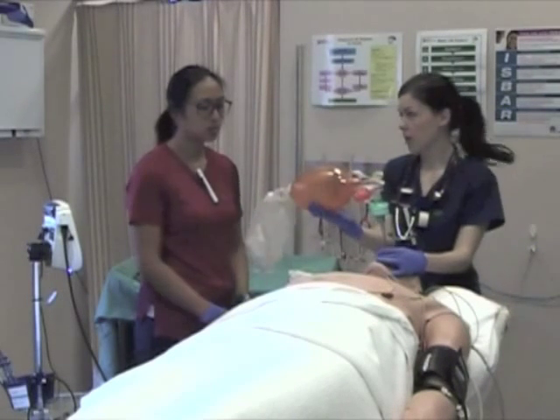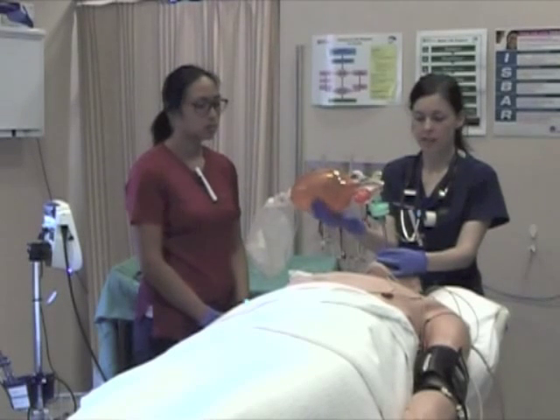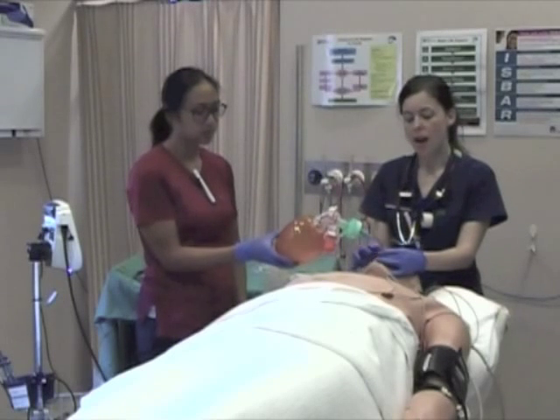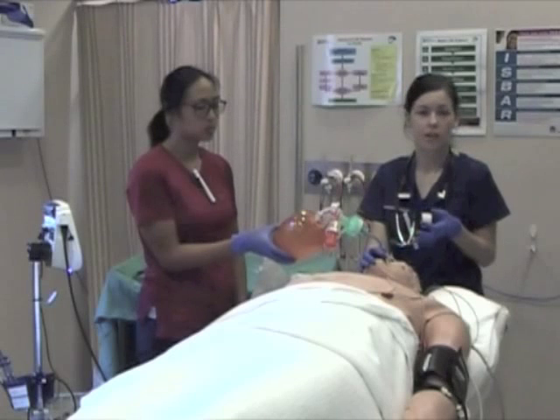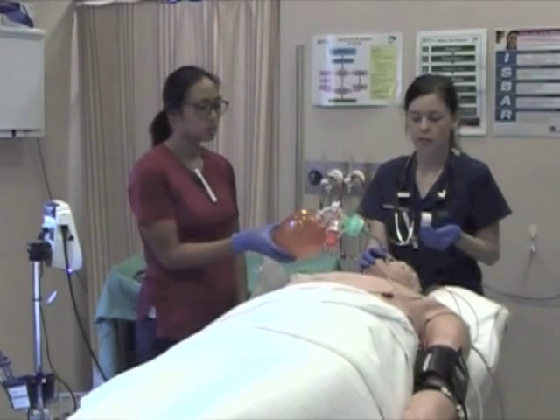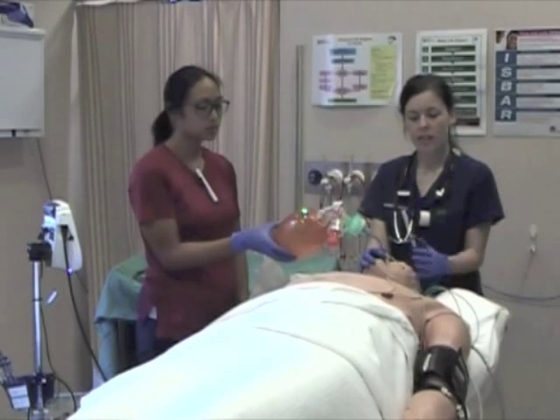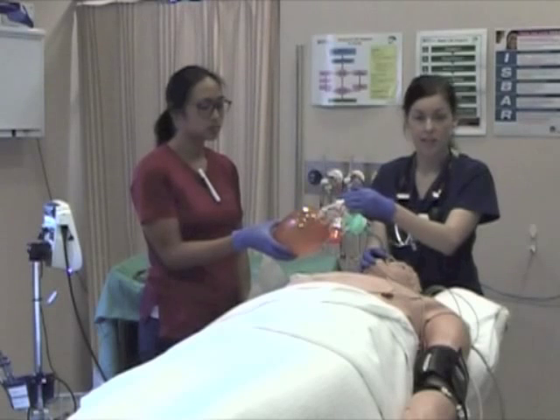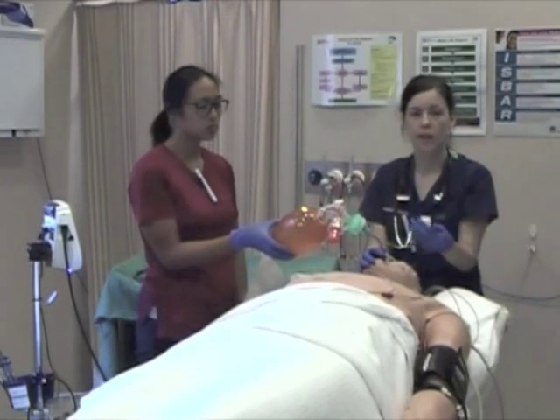Okay, now we're going to move him onto the ventilator. So ventilating an asthmatic, obviously we haven't fixed the underlying problem. He still has a lot of air trapping and a lot of airway resistance, so we're going to ventilate him very slowly at 6 respiratory breaths a minute. We're also going to have a very prolonged expiratory time. If we're still having difficulty with airway pressure, we can also consider disconnecting the ventilator and manually decompressing the chest to reduce some of the air trapping, and then reconnecting him as well.